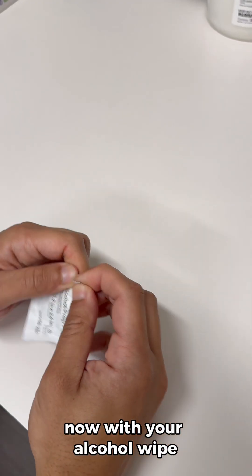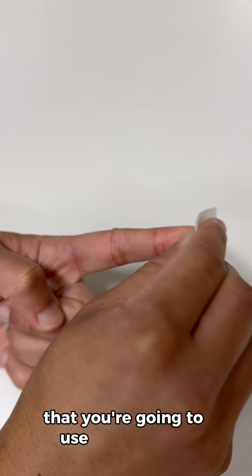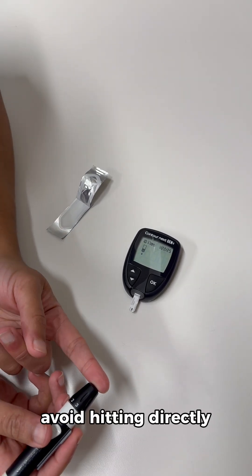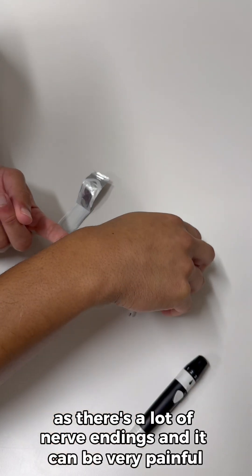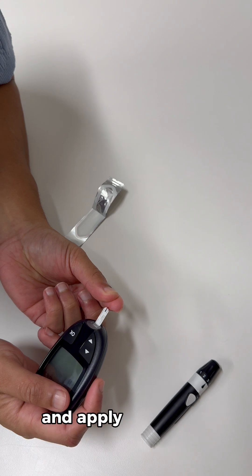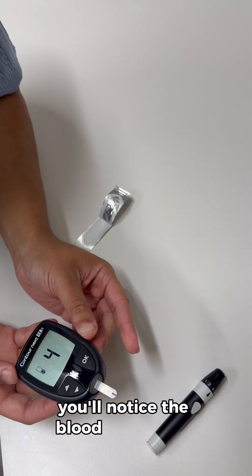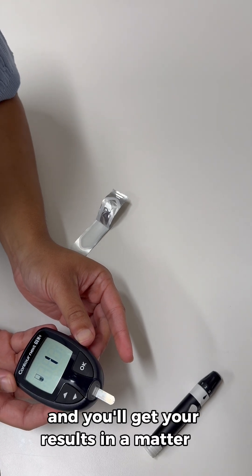Now with your alcohol wipe, go ahead and take it out. Prepare the finger that you're going to use to test your blood sugars. When obtaining your blood sample, avoid hitting directly in the center of your finger because there are a lot of nerve endings and it can be very painful. Try to use the outer portions of your finger. Gently squeeze your finger together and apply the blood to the end of the test strip. You'll notice the blood go up that thin line on the test strip and you'll get your results in a matter of seconds.